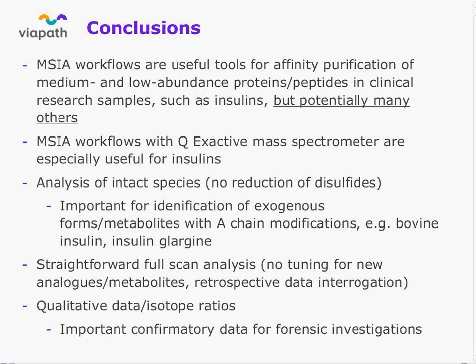a very useful tool. In this case, and in particular in conjunction with the Q Exactive, so the high resolution mass spectrometry that we're using, it's really good for the insulin. It gives us really rich data, and particularly for cases of forensic work, I think that's very important.